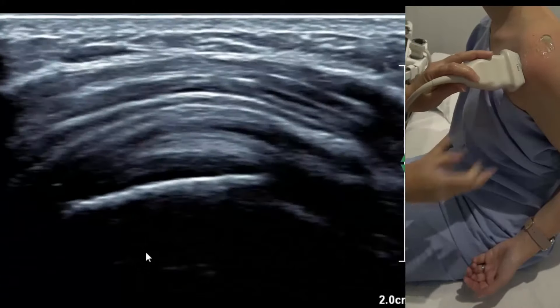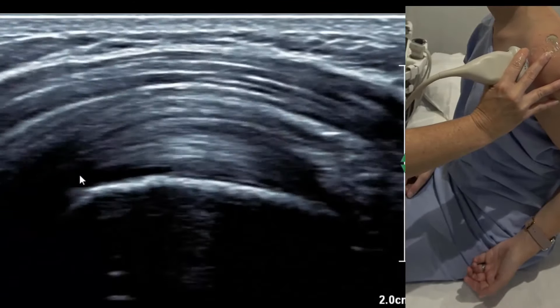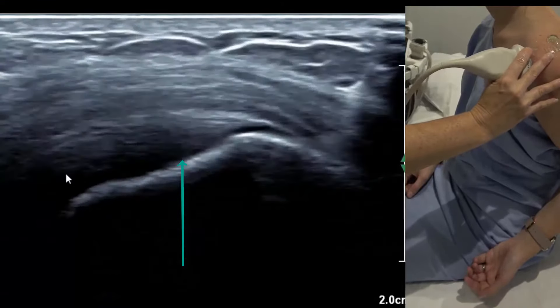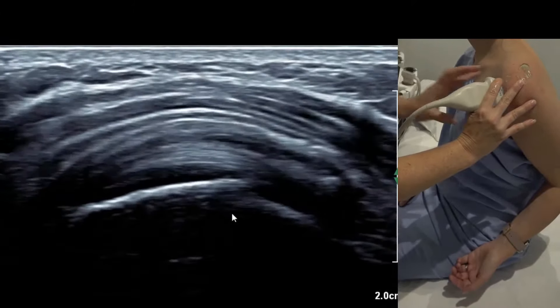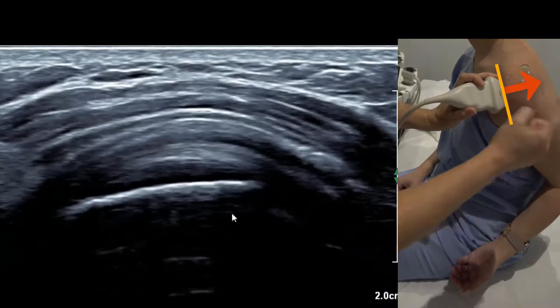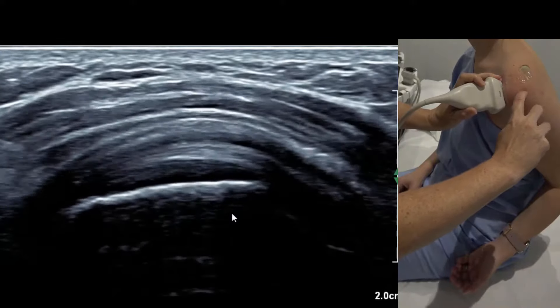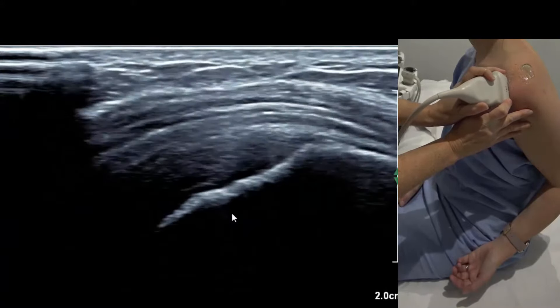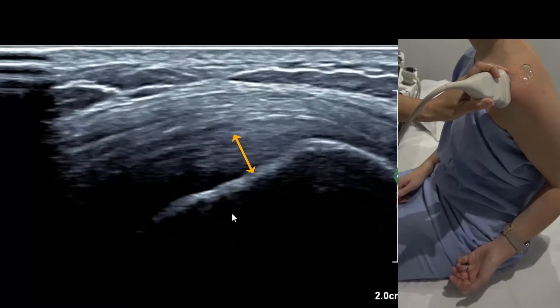We call this the rainbow view. It has to look really good — you've got to see the long head of biceps coming up, peaking, and then diving away from you. Once that alignment is perfect, move the camera at a 90-degree angle to the probe face orientation, migrating backwards slowly. We fall onto a nice little triangle — that's supraspinatus anterior fibres.